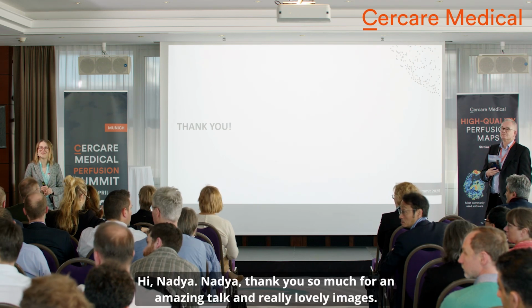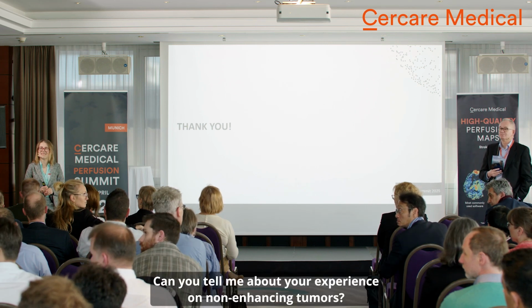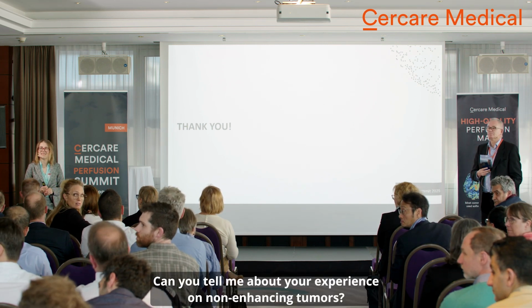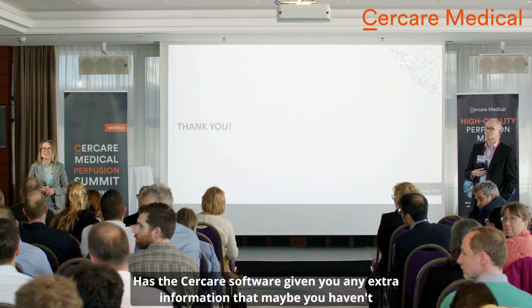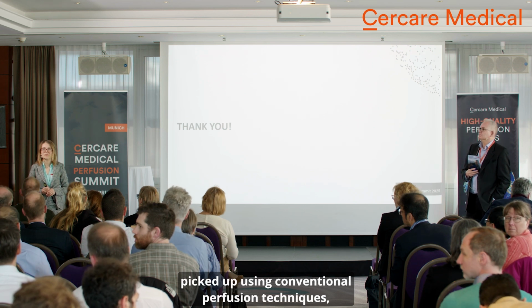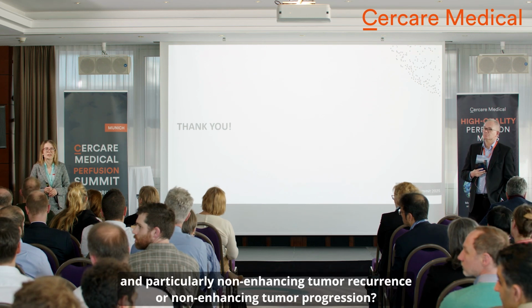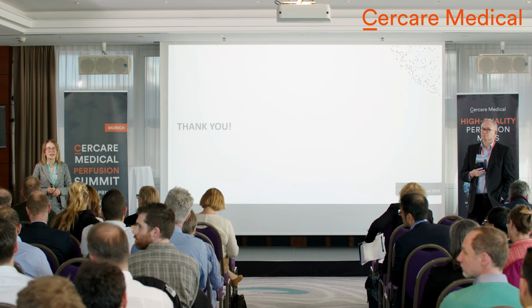Hi, Nadya, thank you so much for an amazing talk and really lovely images. Can you tell me about your experience on non-enhancing tumours? Has the CerCare software given you any extra information that maybe you haven't picked up using conventional perfusion techniques, particularly non-enhancing tumour recurrence or non-enhancing tumour progression?